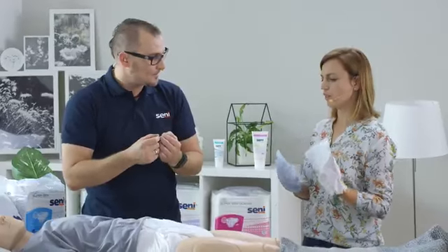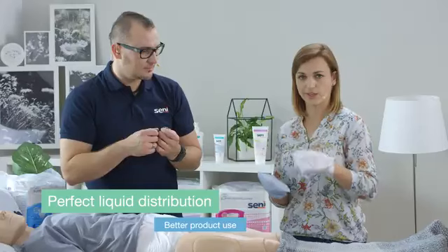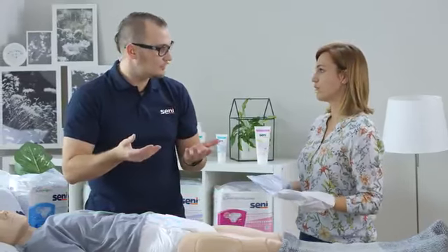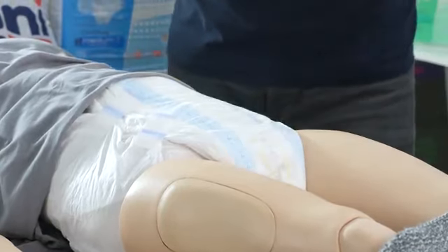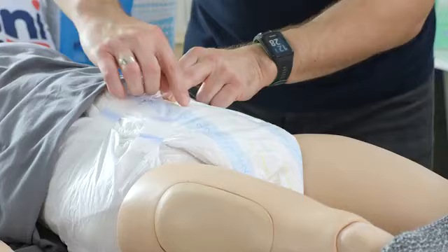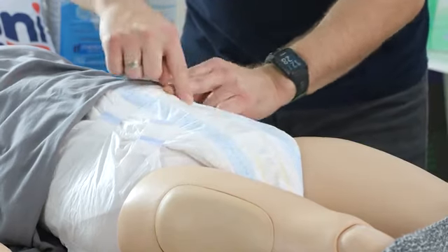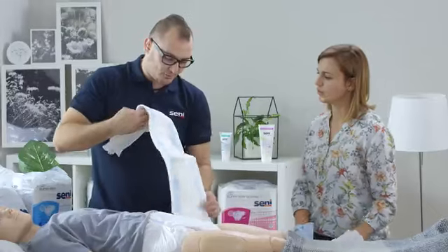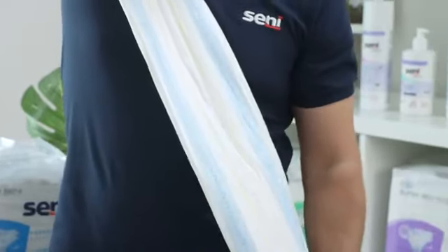Meaning, if we do not have such an additional distribution system, there is a risk that the liquid will stay in one place, and feeling of moisture will appear very soon, with the need to change the product. Exactly. The wetness indicator is a feature associated with this appropriate liquid distribution. Please have a look. You can see 2 yellow stripes that go through the entire length of the product. I have a product prepared here, without packaging. And please look, we have yellow stripes such as these along the entire length.